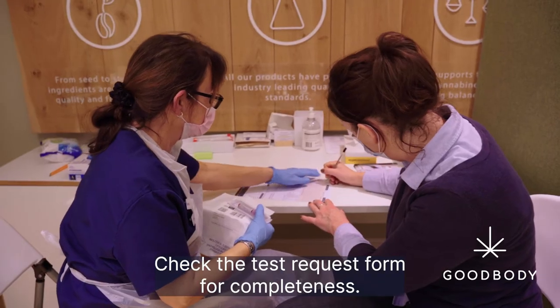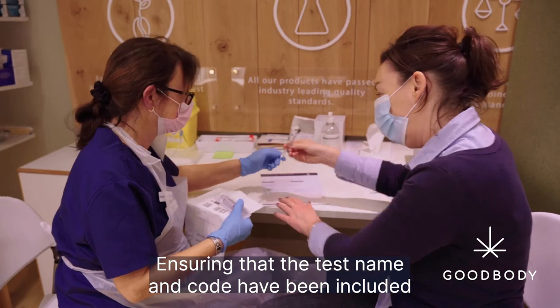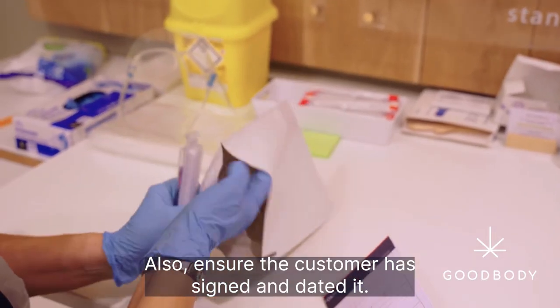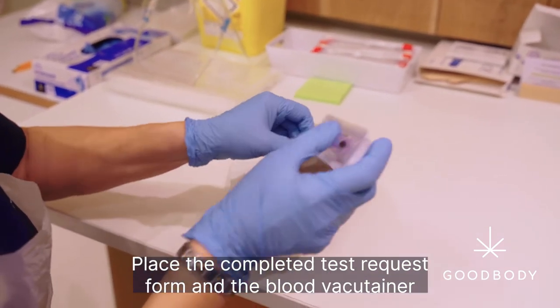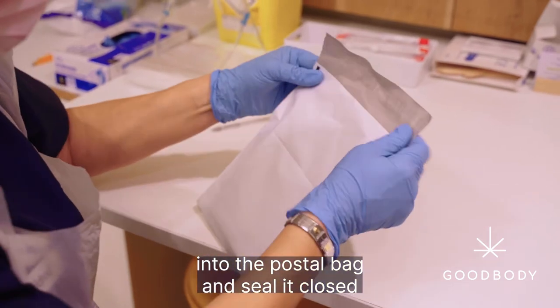Check the test request form for completeness, ensuring that the test name and code have been included, and make sure the form is signed and dated. Also ensure the customer has signed and dated it. Place the completed test request form and the blood vacutainers into the postal bag and seal it closed.